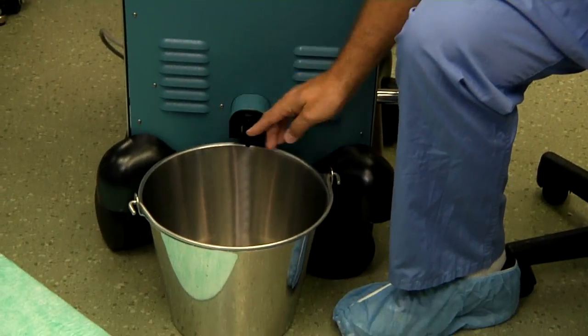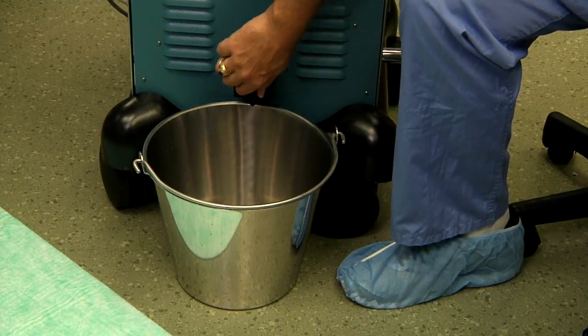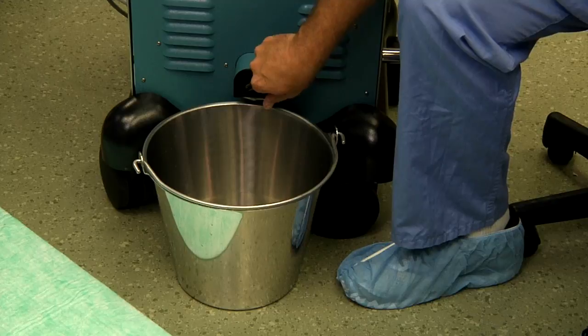Now that all the hardware is on the machine, we're going to fill the water bath of the machine. To start, we go down to the drain of the machine, we open it and ensure that there's no remaining water from previous use, and then shut that valve.